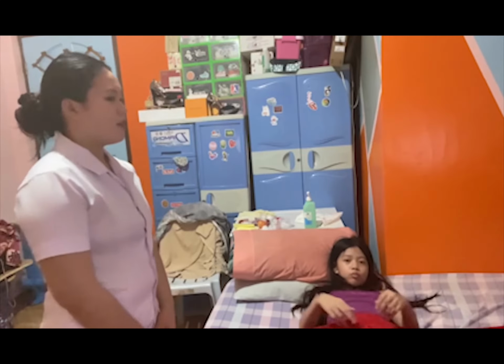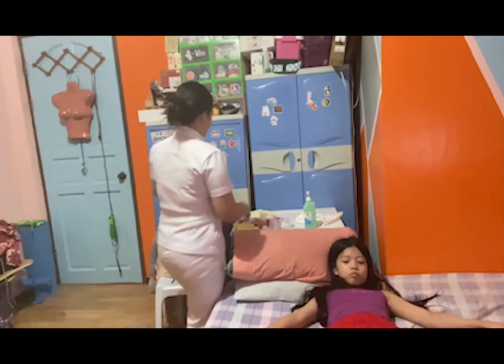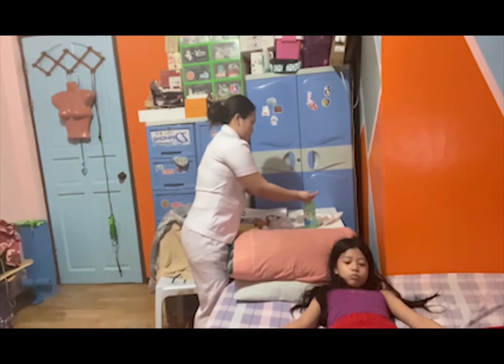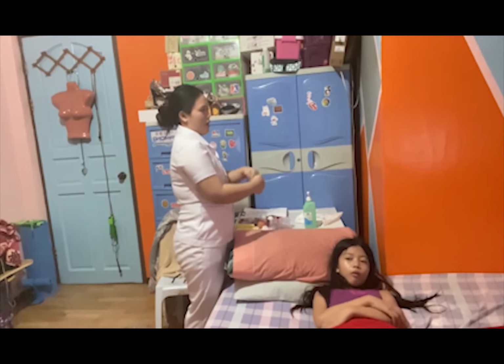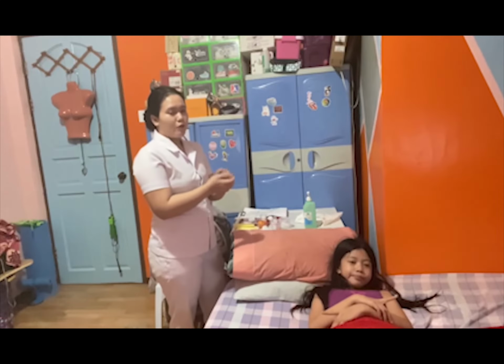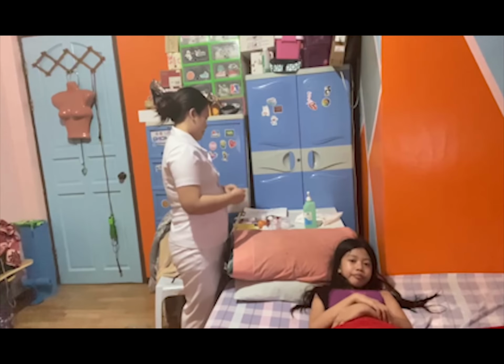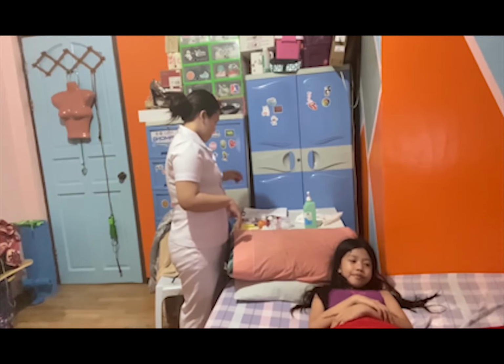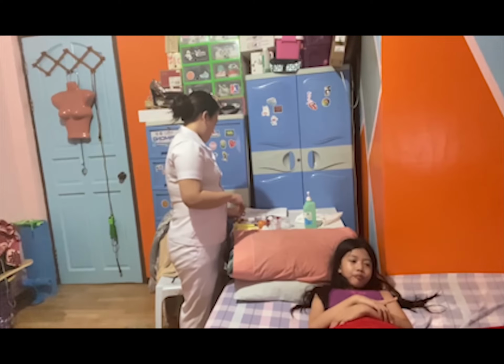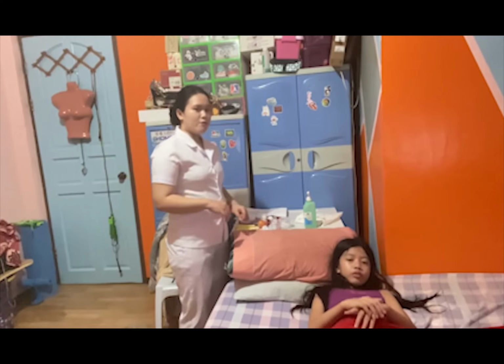Prepare the tray and the corresponding drug. This is important to prevent the spread of microorganisms. Then I'm going to prepare the medication of my patient.